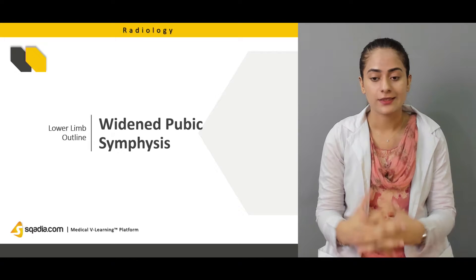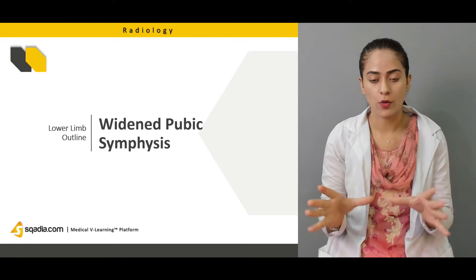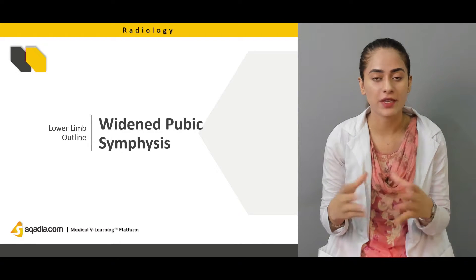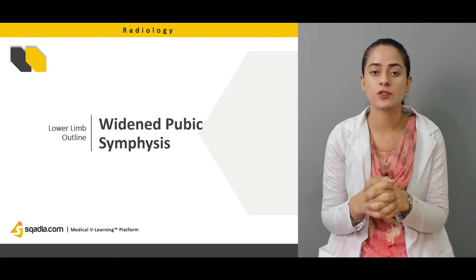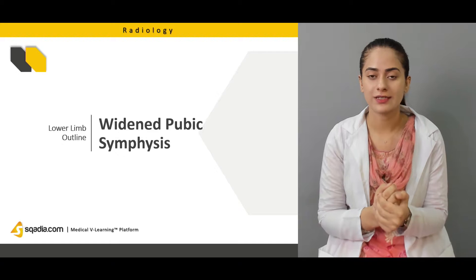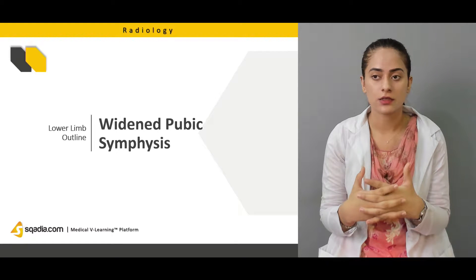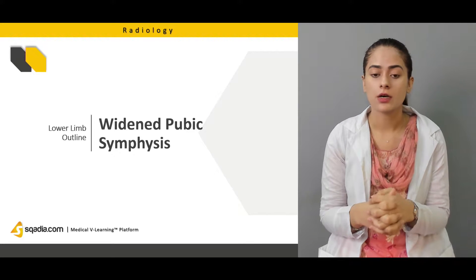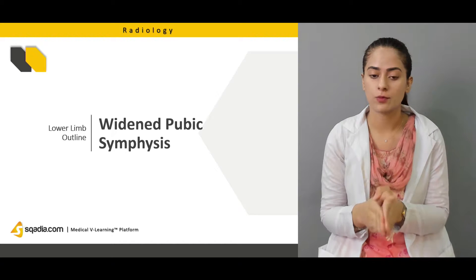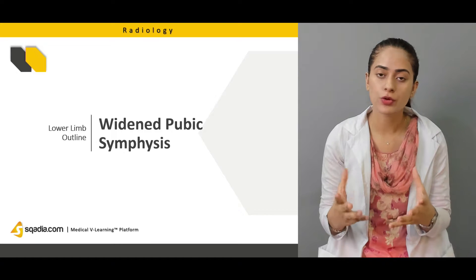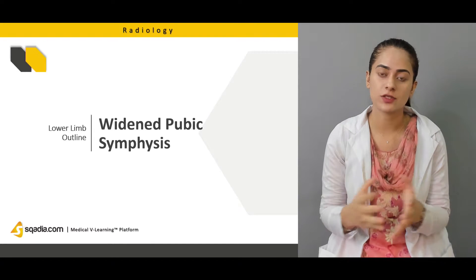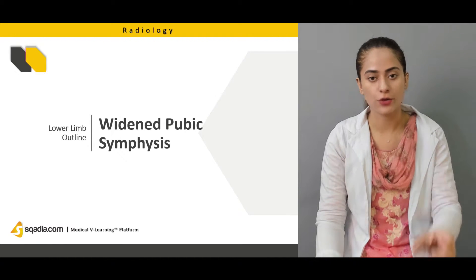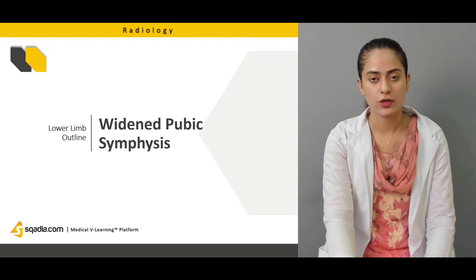There is also the pubic symphysis, which is the inferior point where the two pelvis bones connect. The normal range for pubic symphysis width is four to five millimeters. In conditions like pregnancy, it can increase to nine millimeters. But in normal conditions, any space beyond four to five millimeters is a problem that can be diagnosed by measuring this distance.